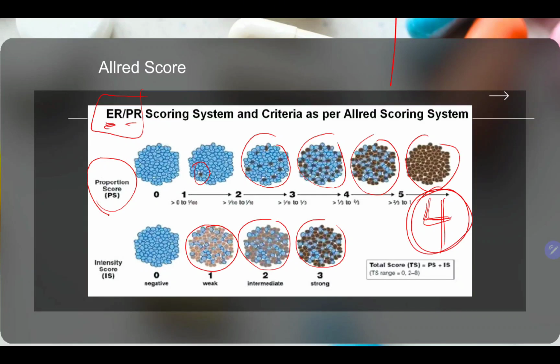Kung ER lang po yung stain, kasi minsan po, ang afford lang talaga ng mga patient is isa lang na stain. So, yun, malalagay po yan sa result is positive for ER and PR po. Or ER lang or PR lang. Okay, but it is usually done po yung tatlo, ER, PR, and HER2/neu for the breast panel. Marami po tayong mga stain, guys, no? Meron pa tayong mga CD21, 23, 19, 20, yan. Depende po yan sa ni-request ni pathologist.